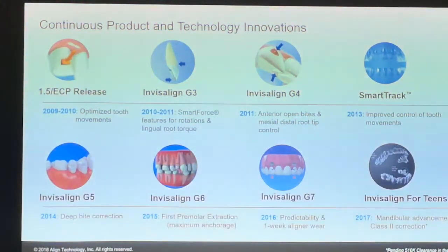You can see the company has invented the software to treat open bite cases, deep bite cases, and also extraction cases. However, since you are just starting to treat cases, I would like to encourage you to start with a simple case first. And in the future, when you are more confident with the system, then you can use Invisalign to treat harder cases.